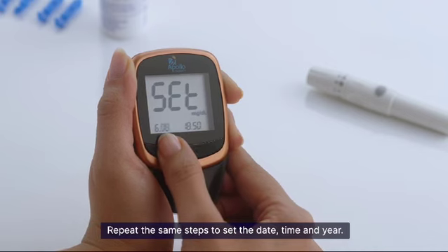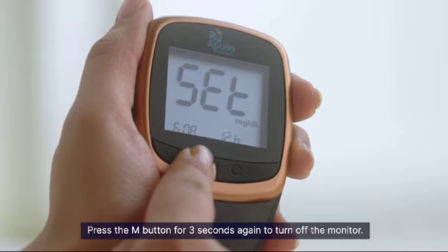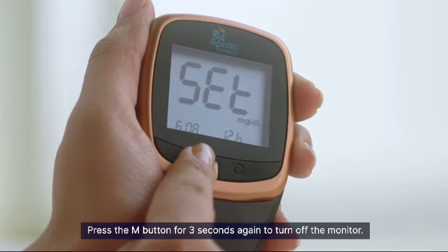Repeat the same steps to set the date, time, and year. Press the M button for 3 seconds again to turn off the monitor.